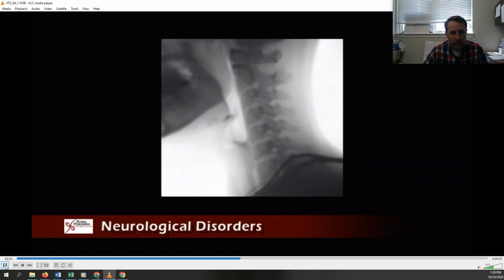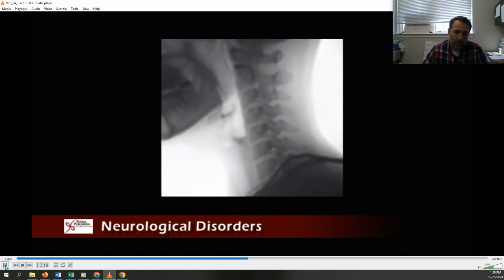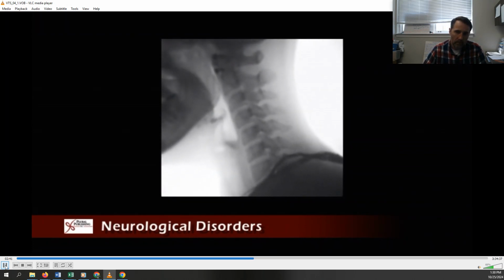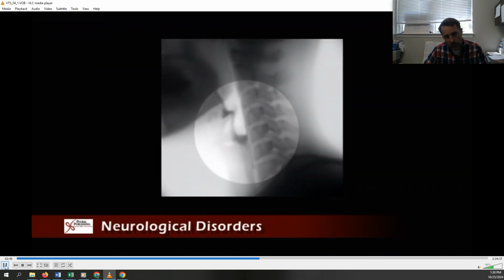The soft palate does not elevate to block off the nasal cavity, and the epiglottis does not tilt to meet the arytenoid cartilages and protect the airway. Markedly reduced hyolaryngeal excursion during the swallow results in reduced airway protection and moderate residue in the piriform sinuses.